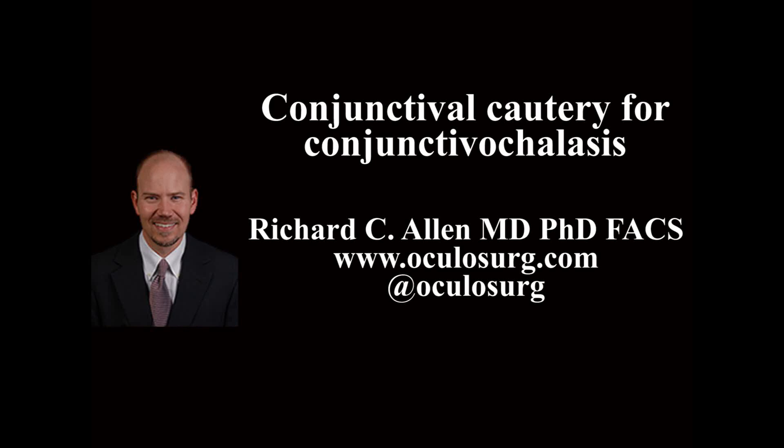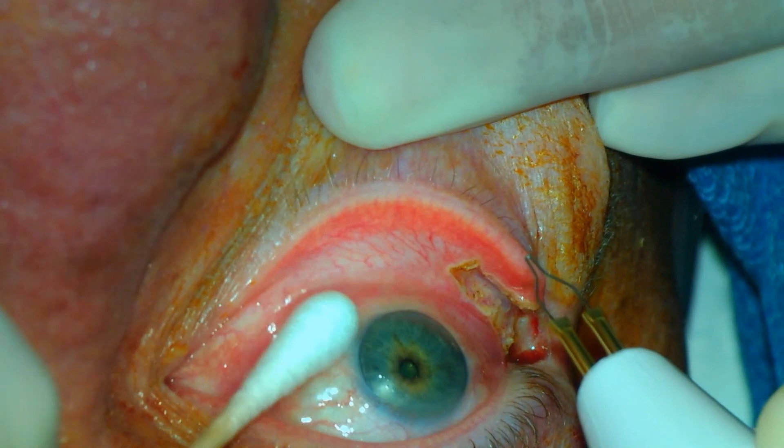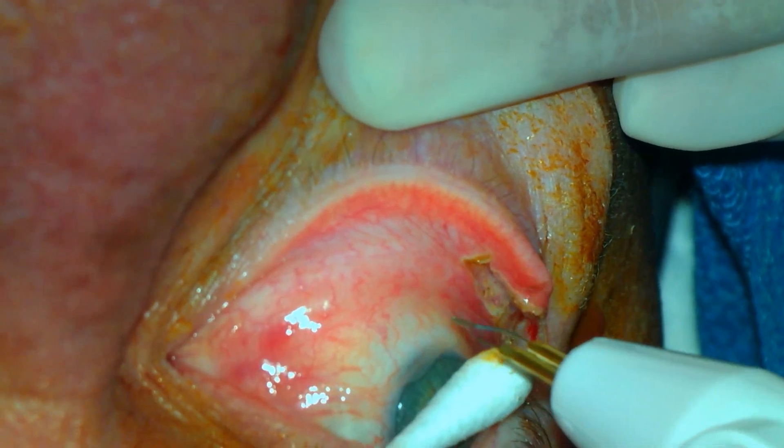This is Richard Allen at oculusurge.com. This video demonstrates the use of high-temperature thermal cautery in the treatment of conjunctival chelasis. This patient is to have a lateral tarsal strip performed as well, which is often done concurrently in my patients with conjunctival chelasis.